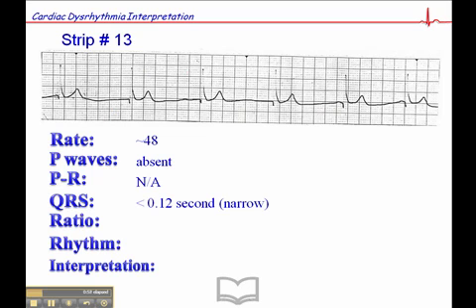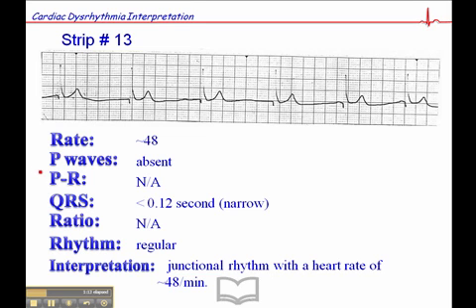If there are no P waves, there's no PR interval, and the QRS is narrow — less than 0.12 seconds. The ratio is not applicable. The rhythm is regular, and when you have a regular narrow complex rhythm without discernible P waves, there's only one interpretation: a junctional rhythm with a heart rate of 48. The intrinsic rate for the AV junction is between 40 and 60, which fits nicely and supports that interpretation.